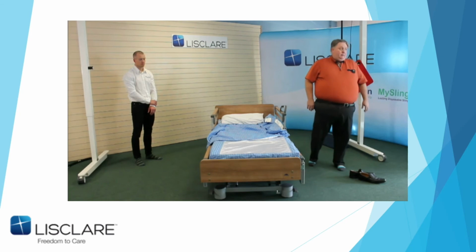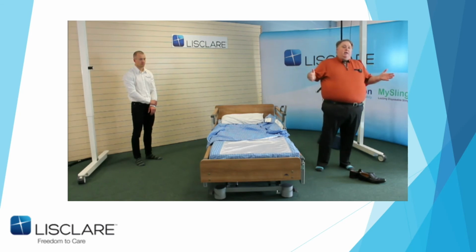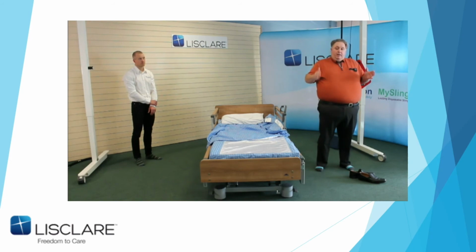Thirdly, double beds. What do you mean about a double bed? If you watch the Regia presentation, that's where it comes in. To me, I'm using this for a 120 wide nursing bed. That's your bariatric size. Nursing beds do not come in double size, as you know, Stuart, after hosting the Regia one.